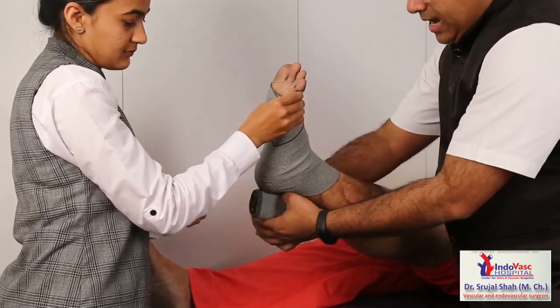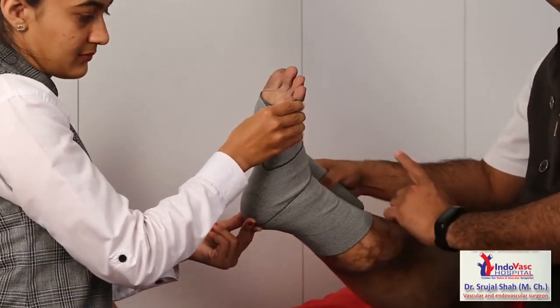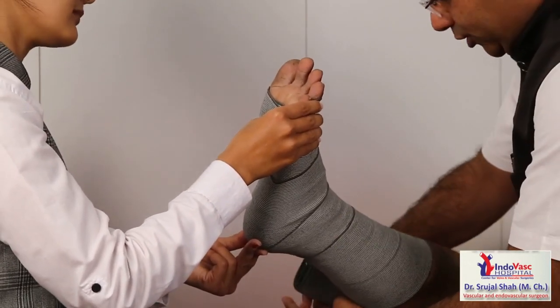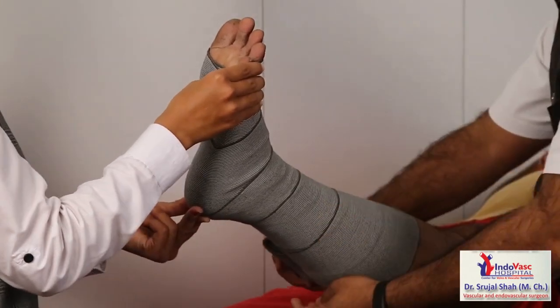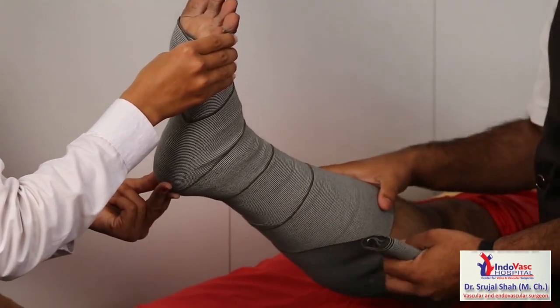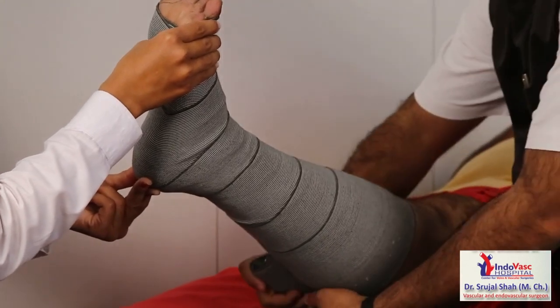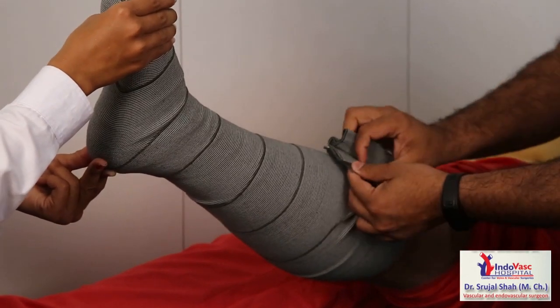We have to apply 50% stretch and there should be 50% overlapping in each wrap — that will give optimum pressure. This is a four-meter bandage which will come up to below-knee length. There are also eight-meter bandages if you are planning to apply for above-knee or thigh length.